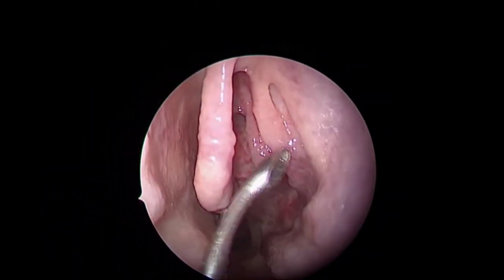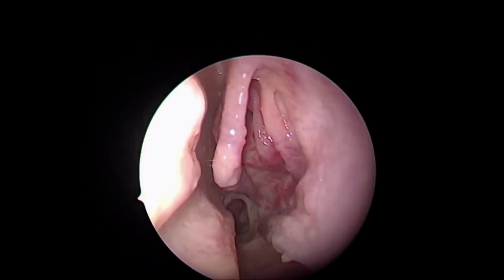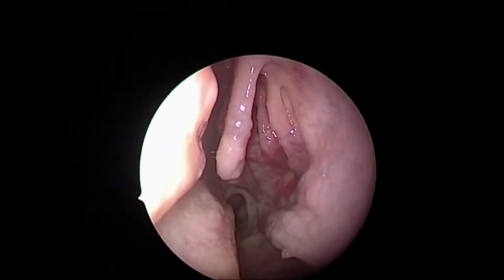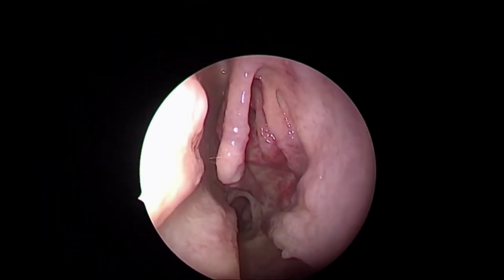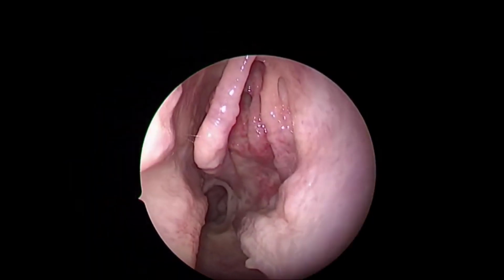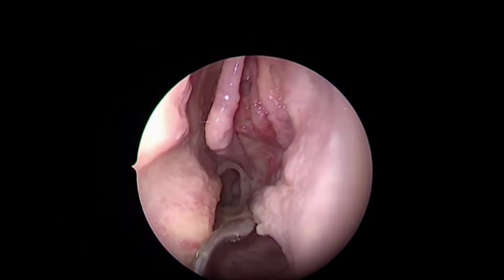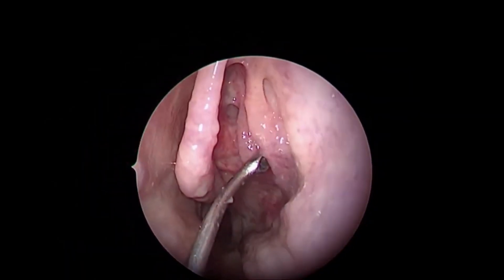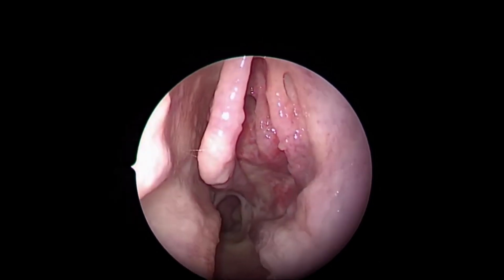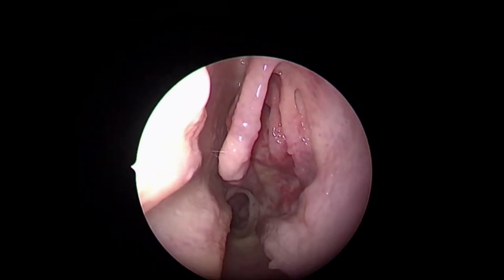Now, coming to the steps of the sinus surgery. As I mentioned, we'll start with the basics of sinus surgery on both sides, and then we'll go to the advanced sinus surgery maneuvers for the maxillary sinus, frontal sinus, and all sinuses for that matter, including open approaches. For the basics, the first step, as I said, is uncinectomy. As I said, well begun is half done, so a good uncinectomy is important.